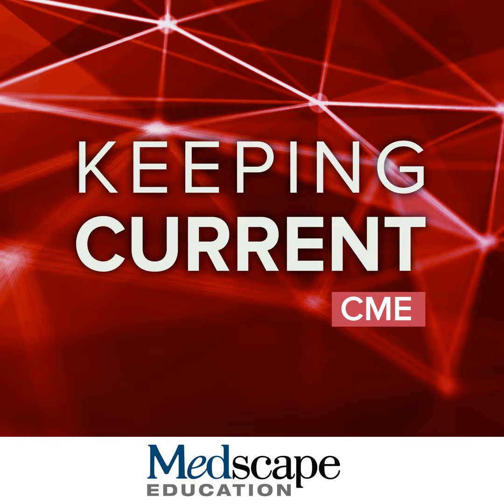So use of gadoxetate in patients with cirrhosis has some advantages. We do have improved sensitivity for HCC. A large meta-analysis, almost 16,000 patients, showed that compared to all other modalities, gadoxetate has the highest overall per lesion sensitivity and positive predictive value, and that is particularly important for lesions which are less than 20 millimeters in diameter.